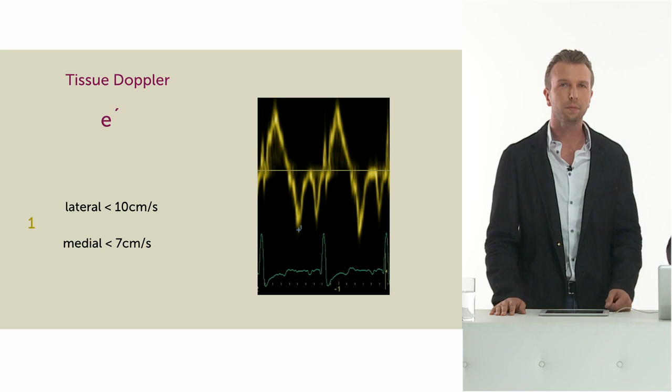Right. So this is an important thing to note, but there's another intriguing thing, and this is maybe a little bit of a criticism. They call the E prime one parameter. Yeah, it's one parameter. Because otherwise it would be 5 parameters. I would guess that's easier, because we'll see afterwards, if you have 5 parameters, there's always 3 to 2. Okay, so we'll have a majority vote. Yeah, and so we often get to the 50-50 situation. But keep this in mind, the guidelines state that this is one parameter, lateral and medial.